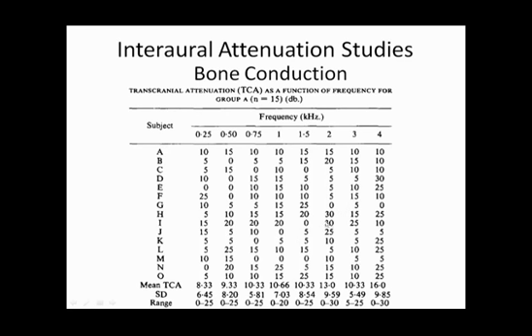Interaural attenuation is actually 30 dB. So this shows us that interaural attenuation actually has a range. Here we see a range from 0 to 25. Over here it's 0 to 30. At 4000 hertz it's 0 to 30 dB. We use 0 dB interaural attenuation for bone when we determine the need for masking, just to be on the conservative side, or the safe side.